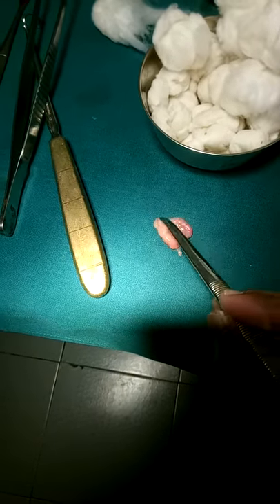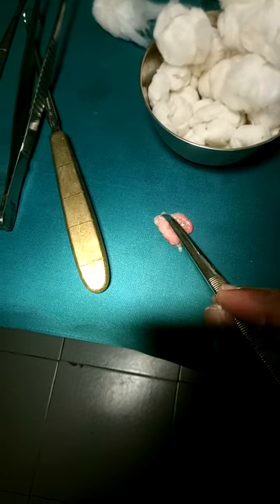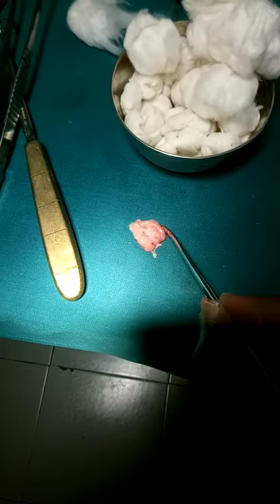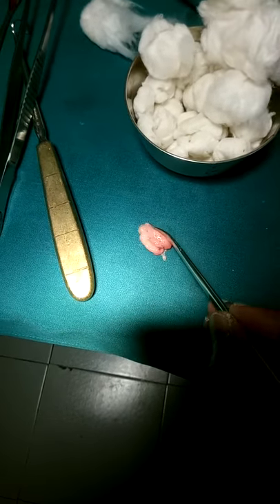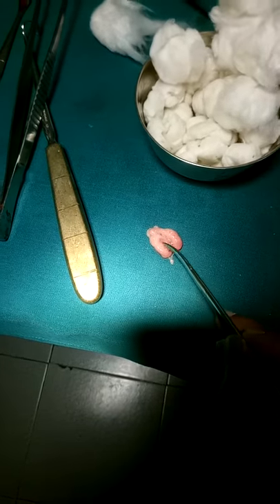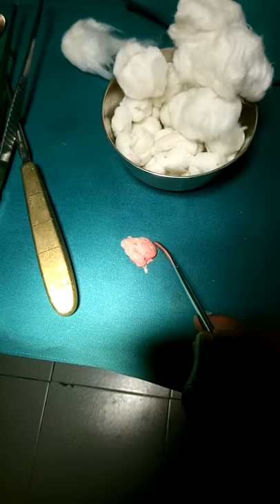This side is towards the posterior choanal side, and this is towards the oral cavity. The whole adenoids were removed in one block using the cold instrument — the adenoid curette.